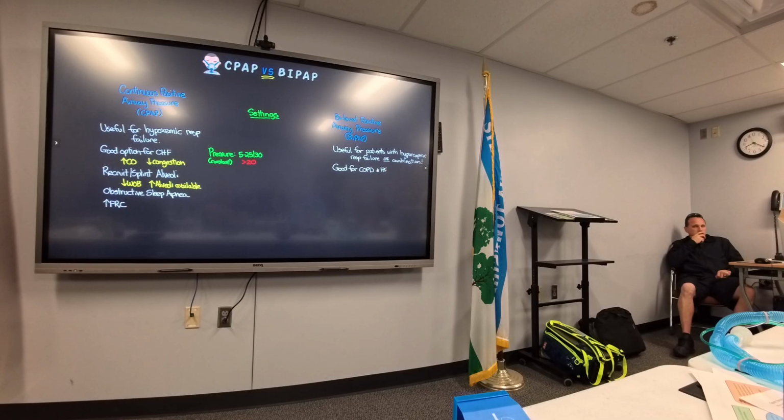We're going to see some of the same benefits that we were just talking about with CPAP with our heart failure patients, as well as COPD here. This is patients who are having trouble with ventilation, and that's one of our big benefits to BiPAP. Now, BiPAP is a really good option to help prevent intubation, or if we need to wean really difficult patients from the invasive ventilation, BiPAP has really been shown to decrease mortality in these patients.